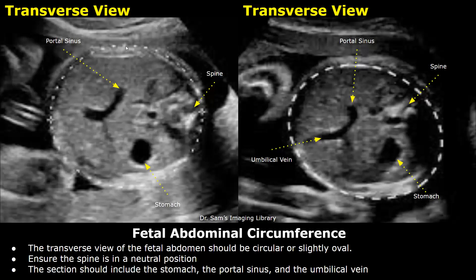This L-shaped structure going towards the liver is the portal sinus, and this is the umbilical vein. This round anechoic structure is the stomach, and this hyperechoic structure is the spine.